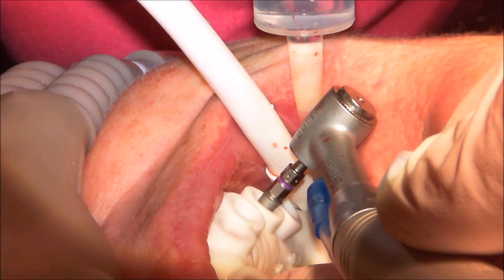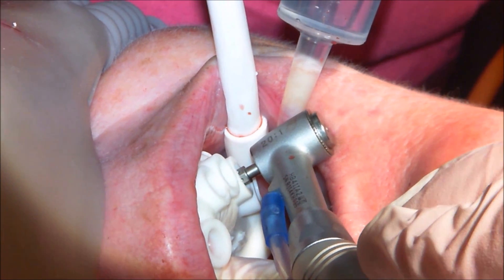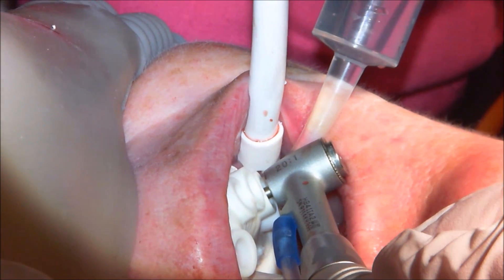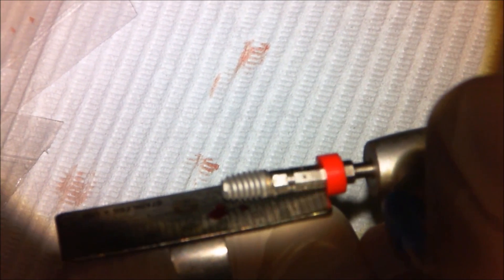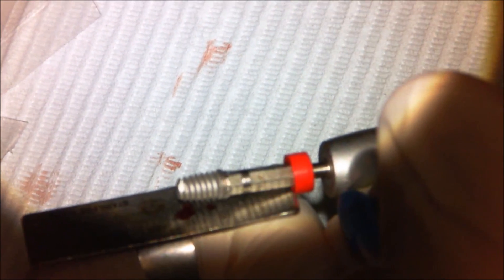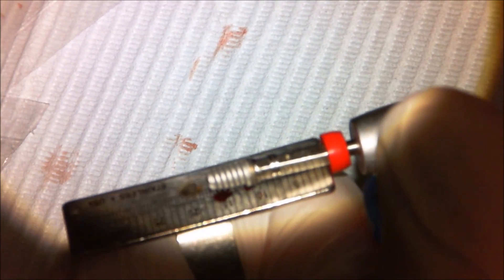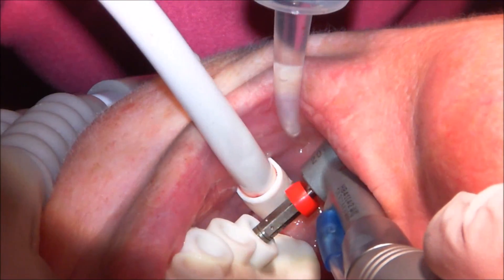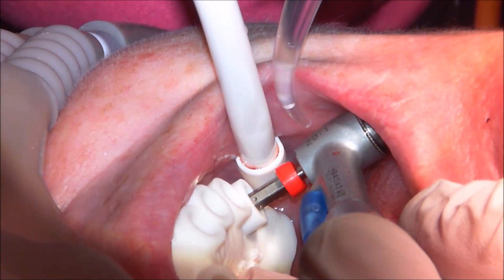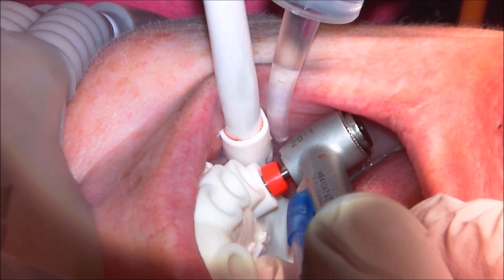This implant is a 3.5 by 10, and that one was supposed to go in one millimeter short of platform. I'm now using what looks like an endo stopper — just a little rubber stopper available from 3D Click Guide. These can be very useful as drill stops or depth gauges on any implant instruments. Just like doing endo, I've set the stopper to the correct depth and I sink the implant until the stopper is even with the top of the tube. You'll see it stop right there.